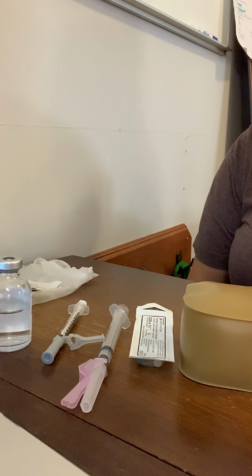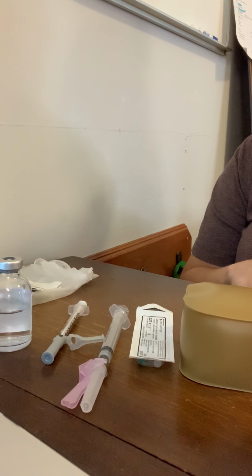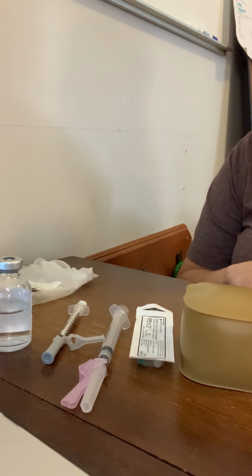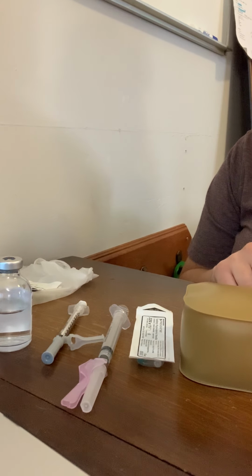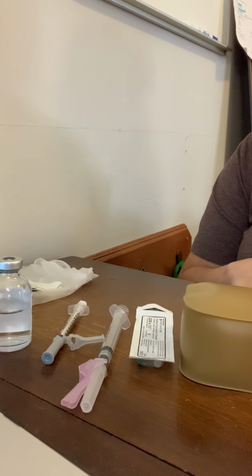The doctor has ordered 4,000 units of heparin sub-Q every morning and 25 milligrams of Phenergan IM every as needed for nausea. I am going to check for lab results pertinent to my medications. So that would be the PTT for heparin, and everything looks good. There are no lab results for Phenergan.